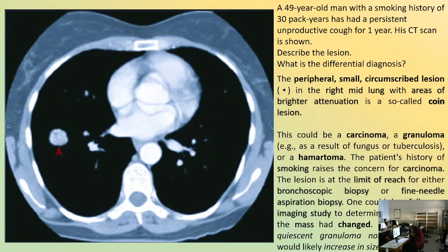Other cells make the granulomas, make these nodular accumulations of inflammatory cells. Which cells are these? The epithelioid cells. Some time ago, they were macrophages.